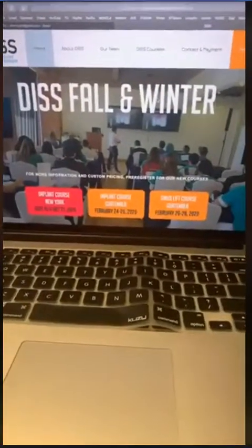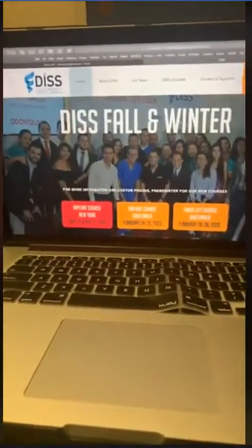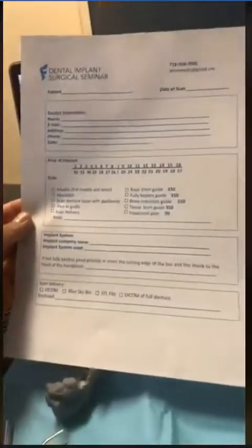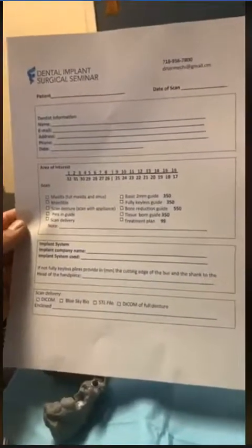So here is our website, okay? The website is Dental Implant Surgical Seminar. You will soon find a button on the Dental Implant Surgical Seminar site where it says download a prescription. Do not do that yet, because it's going to tell you to download a prescription for your surgical guide. You can certainly come to the site, download the prescription, and I have a copy of the prescription right here. It's actually asking you a few questions about the patient. I ask what you are doing on this particular patient.